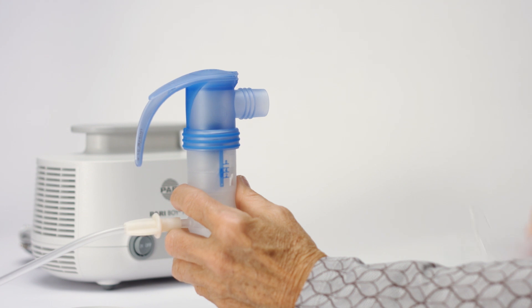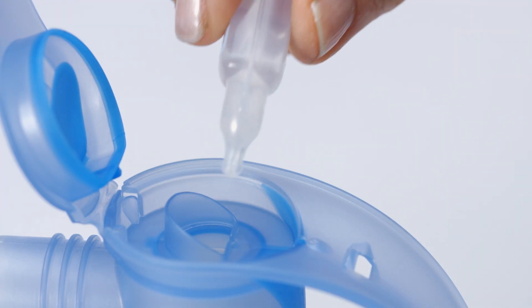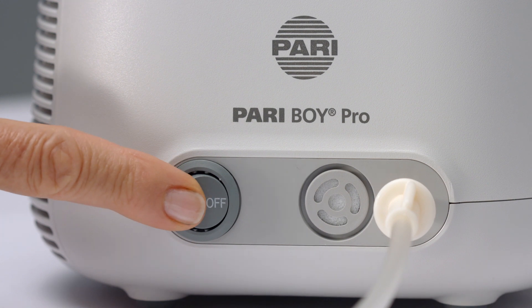Attach the PARI PET-S system if you want to carry out PET treatment simultaneously. Then pour in the inhalation solution. Sit upright in a relaxed position and switch your device on.